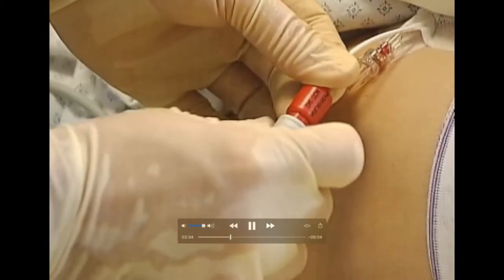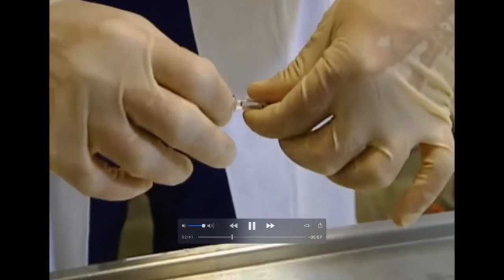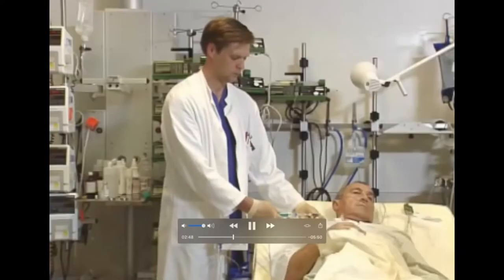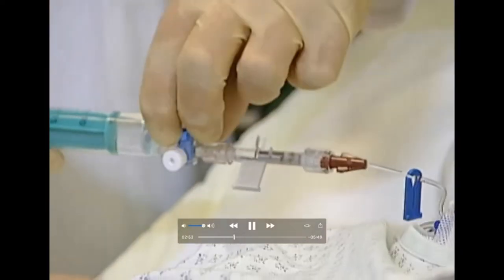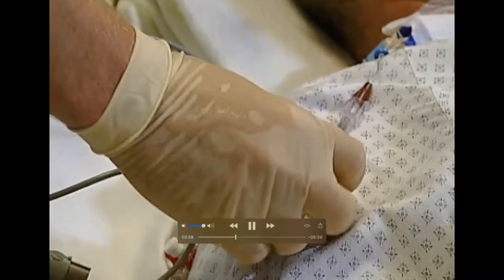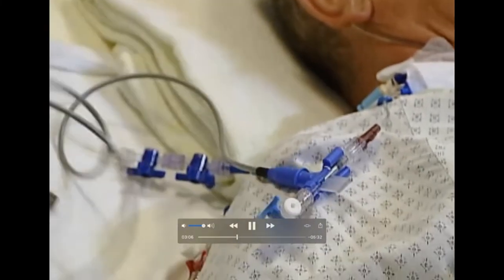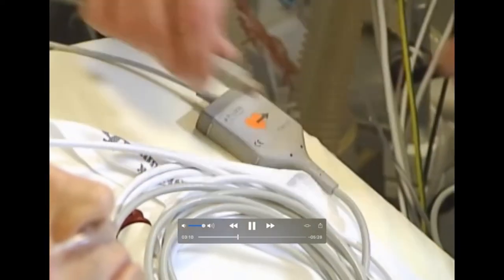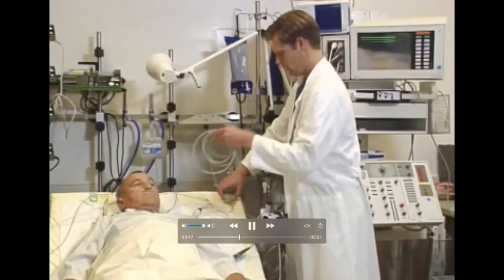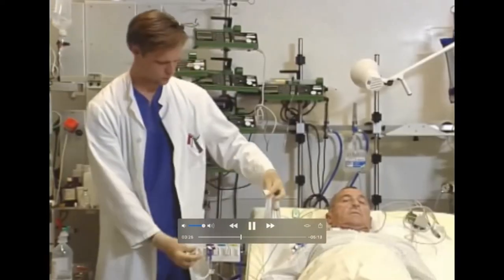Gently connect the red thermodilution connector of the arterial catheter to the corresponding part of the PiCCO thermodilution cable. Please use a three-way stopcock for the attachment of the injectate temperature sensor housing to the distal lumen of the central venous line. Finally, flush with saline solution. Connect the injectate temperature sensor housing carefully to the blue injectate temperature sensor cable. You should hear a click sound on connection. Attach the other end of the injectate temperature sensor cable to the interface cable, which has already been connected to the arterial catheter. You can now fix the orange color-coded plug with the corresponding socket on the front panel of the PiCCO Plus.